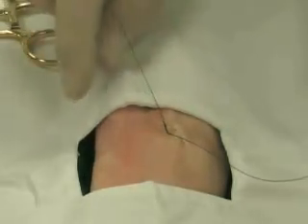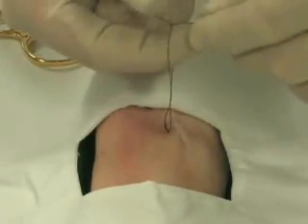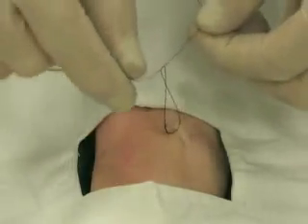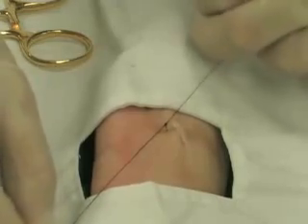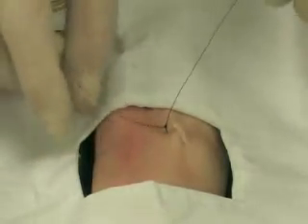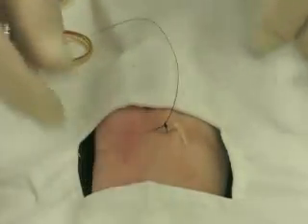For the second suture, with the long end of suture, put your thumb behind it with the short end, pull it over your thumb, again pinch and push the short end through the hole. This time you'll want to cross your wrist, your hands, to get the suture to lie flat. Now that your second knot is tied, it won't slip, and from here on no surgeon's knot is necessary. Then alternate back over your index finger, pulling apart, behind your thumb, pinch through, pull through, and cross. 4 to 6 throws is adequate.